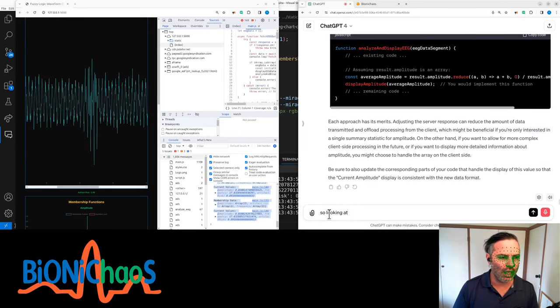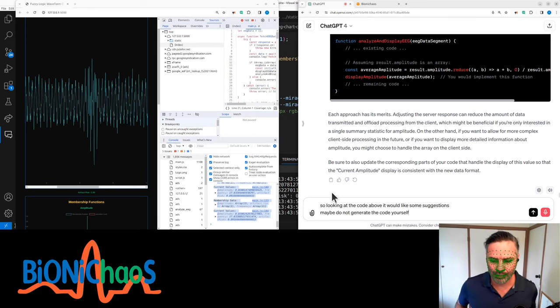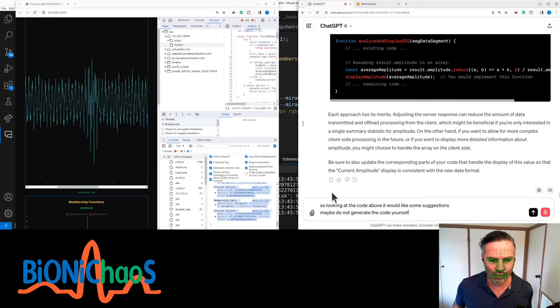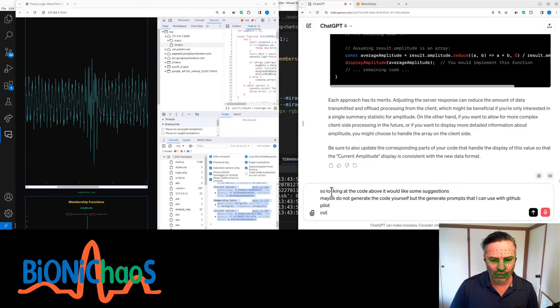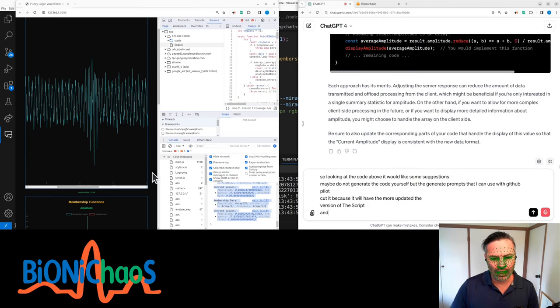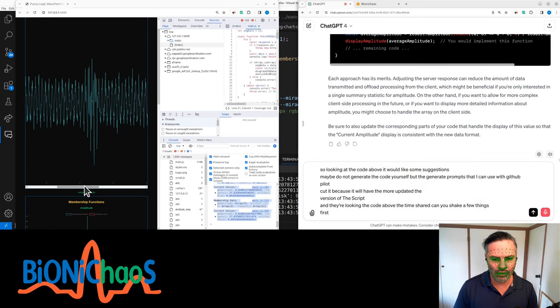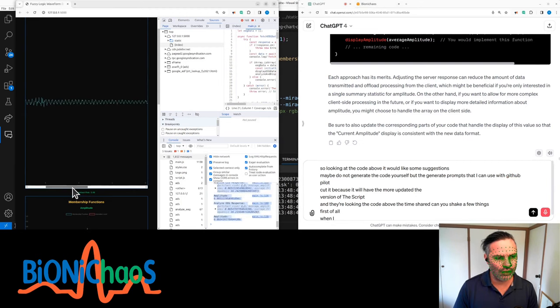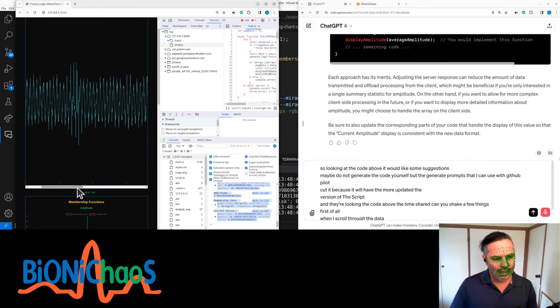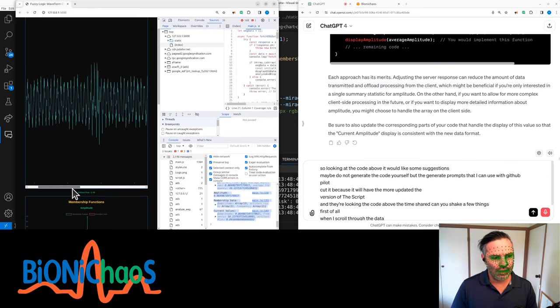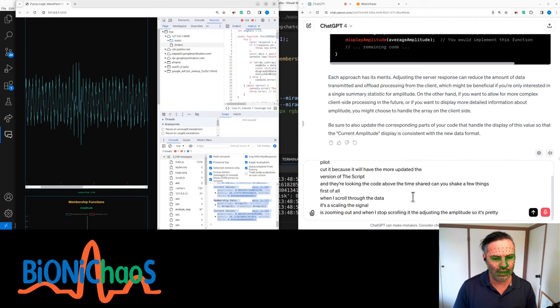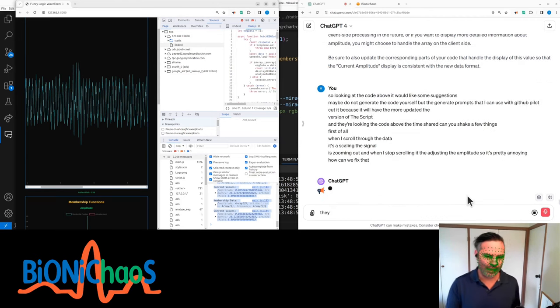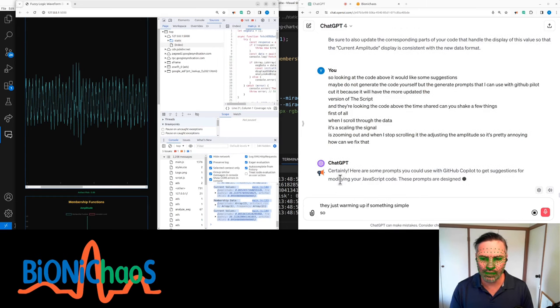So looking at the code above, I would like some suggestions. Maybe do not generate the code yourself, but generate prompts that I can use with GitHub Copilot because it will have the more updated version of the script. Now, looking at the code above that I shared, can you check a few things? First of all, when I scroll through the data, it's scaling the signal. It's zooming out, and when I stop scrolling it, it's adjusting the amplitude. So it's pretty annoying. How can we fix that? Just warming up with something simple.